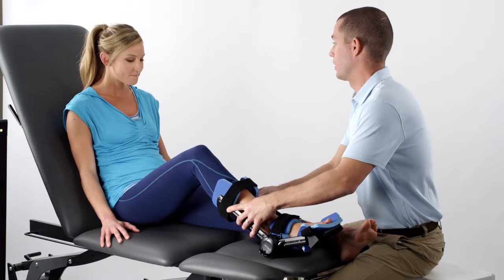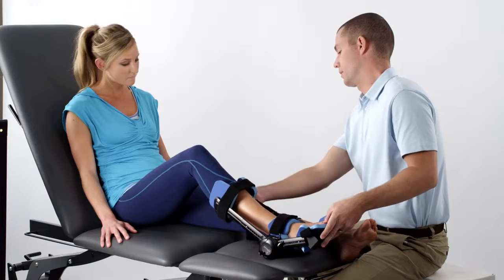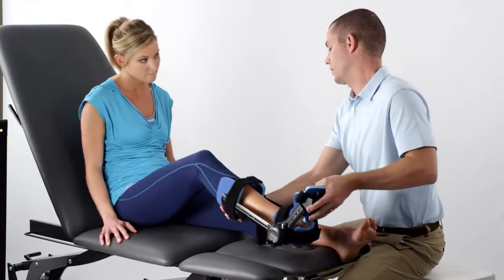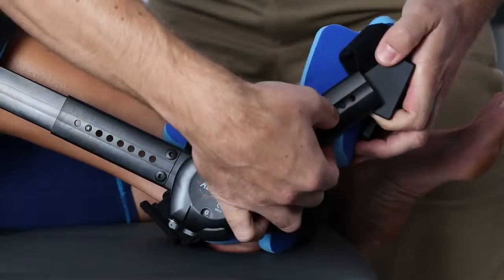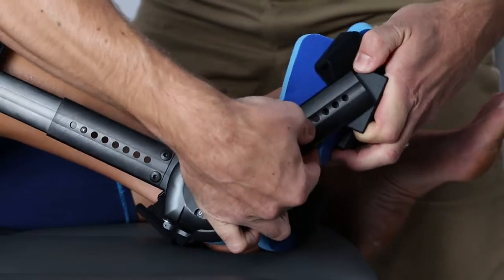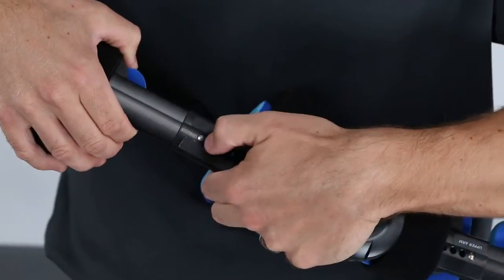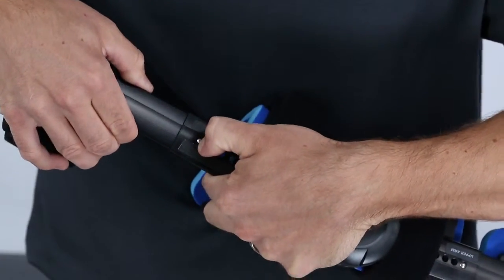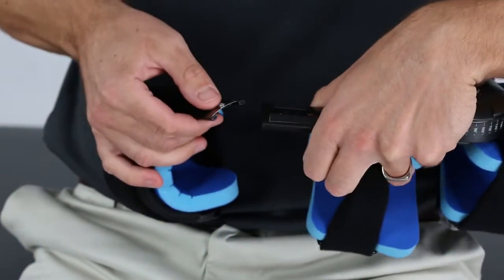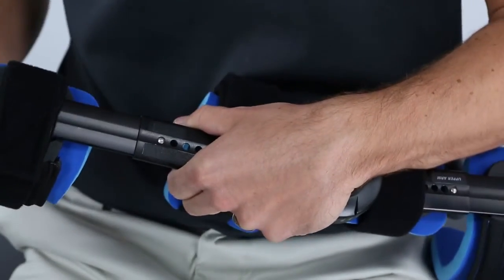Depending on the patient's anatomy and condition, additional ankle adjustments may be required. Position the proximal strut so the contour cuff does not restrict knee motion. If you do need to adjust the strut, depress the leaf pin and lengthen or shorten the strut as needed. Note that extending the strut length beyond the last adjustment hole may cause the leaf pin to fall out of the strut. If this happens, reinsert the leaf pin into its housing and reconnect the two struts.